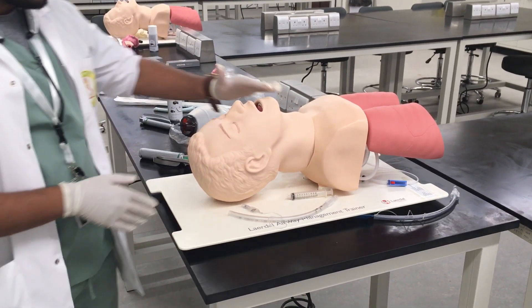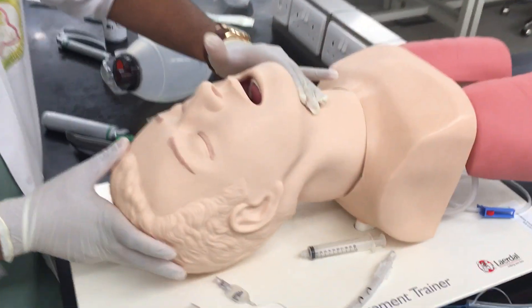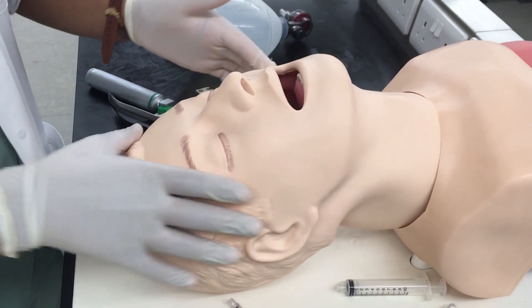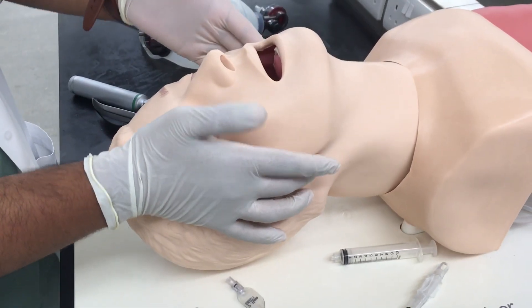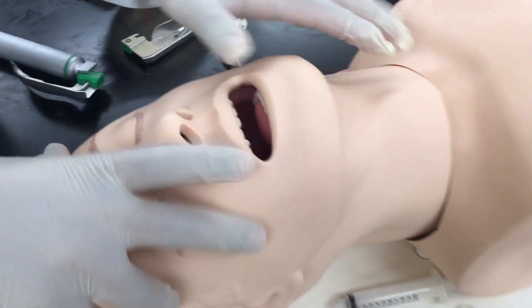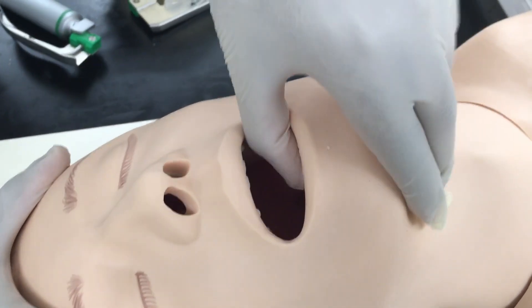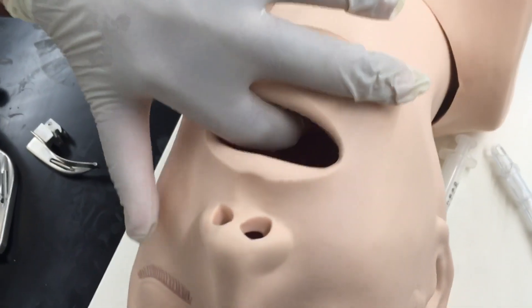For difficult to intubate, focus on three things: the thyromental distance, which is from the chin up to the thyroid cartilage; the mouth opening, which should be about two fingers; and whether there is any subluxation of the jaw joint. Also check the mouth for absence of teeth, the uvula, the pillars of the palate, and the Mallampati score.